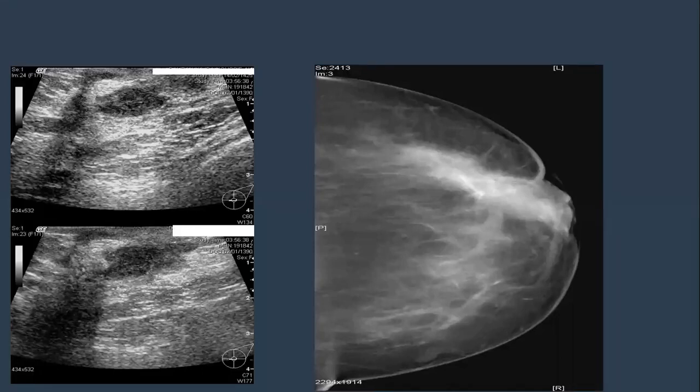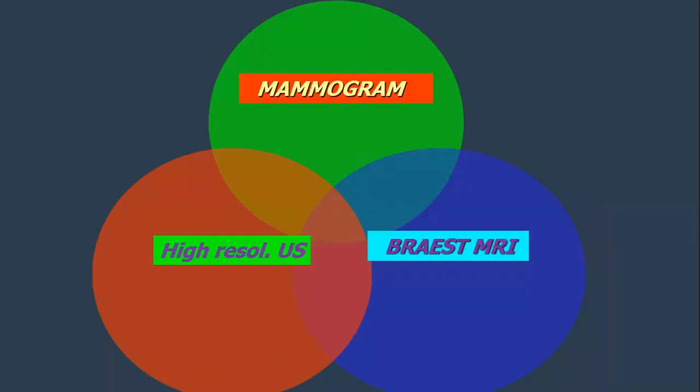TB, yes. Yeah, if I remember that case, it was tuberculosis. It was a chronic infection, likely. But the history, the descriptions and history, you have to take all the constellation of findings to get your diagnosis.